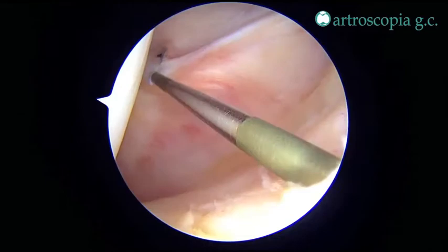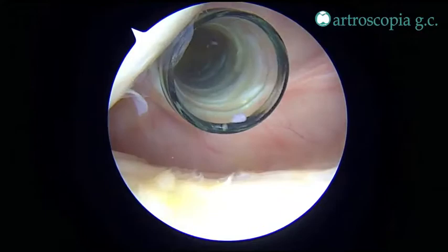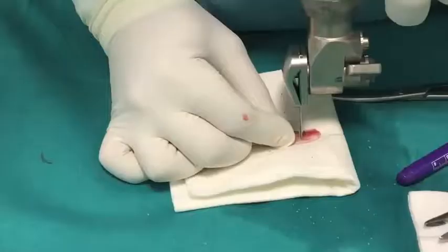A posterior middle portal is created and an 8.5 mm cannula is used. A combination of shaver and tissue ablation device are used to remove all PCL remnants from the tibia.